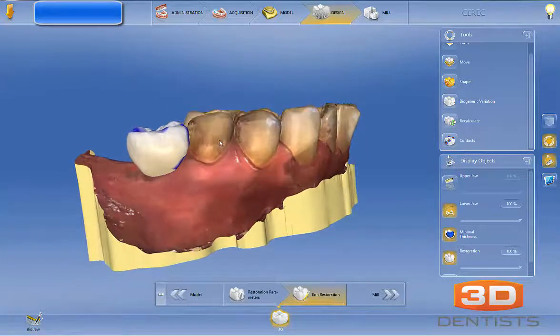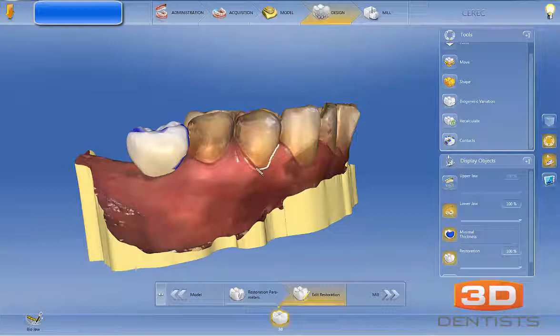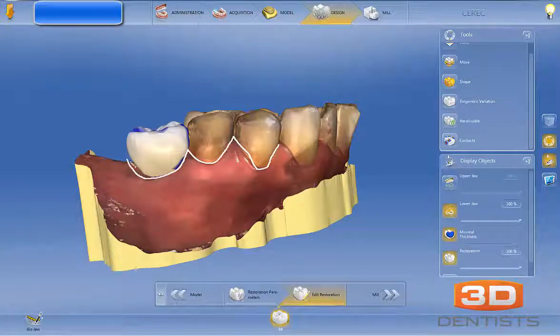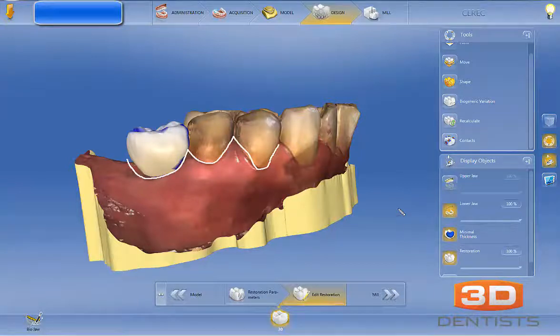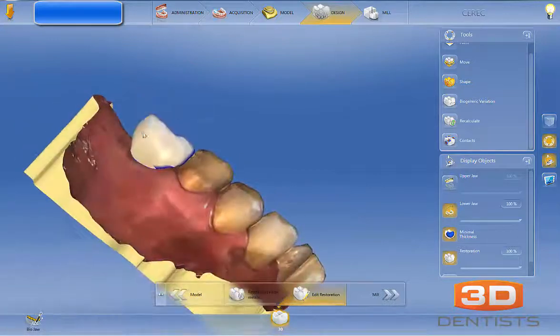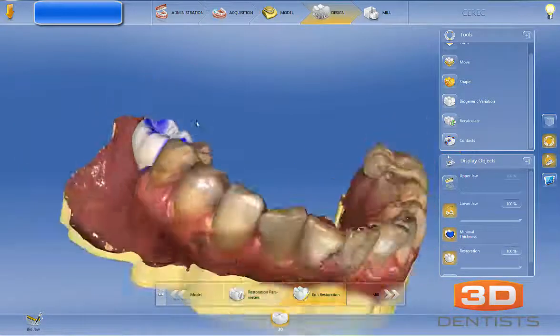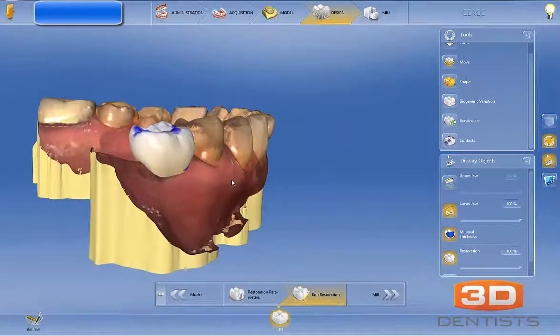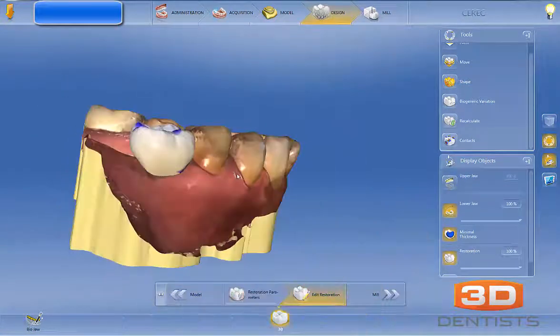The general things I look at: we can see that our gingival margin is drawn kind of in the right spot. Whether or not this tooth is wide enough is one question I would have, but certainly the gingival margin is drawn in the right spot, and the same for the lingual — so care and attention has been given there. This looks like it's ready to go, so it's quite easy to go ahead and export this out.